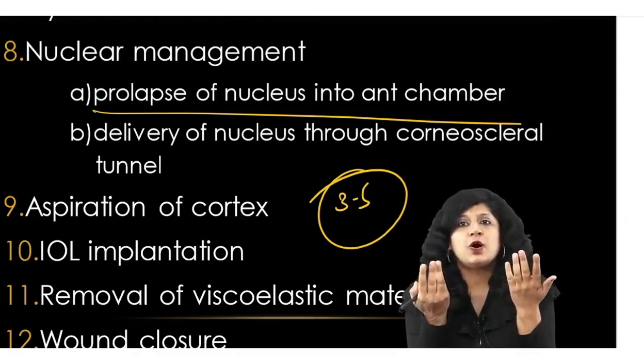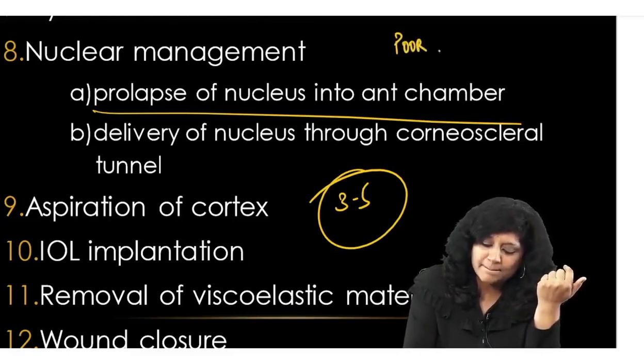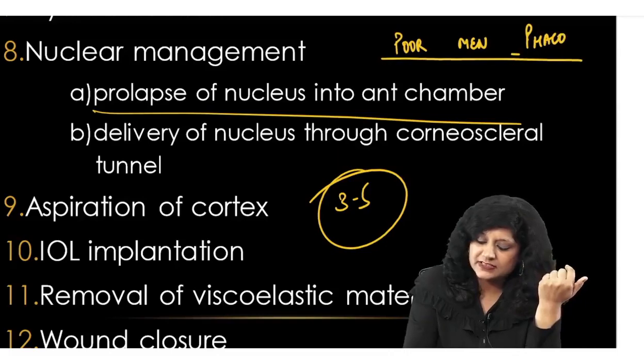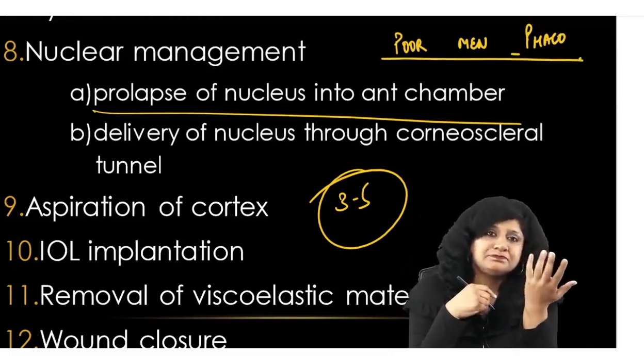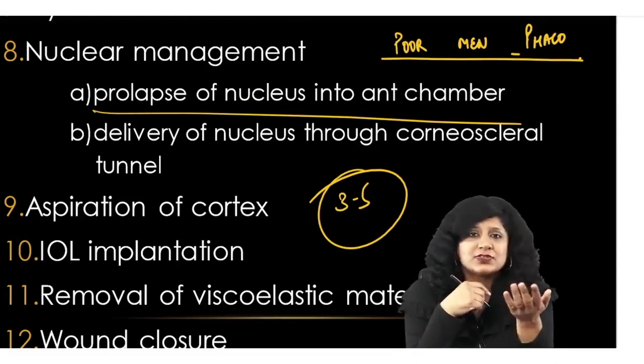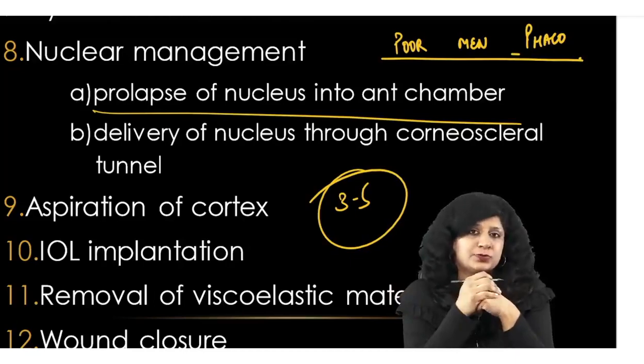So a kind of manual phaco, or it is the poor man's phaco. I can say that basically this is a poor man's phaco, for those people who want good results, small incision surgery, but cannot afford phaco. This is a very good option for them.